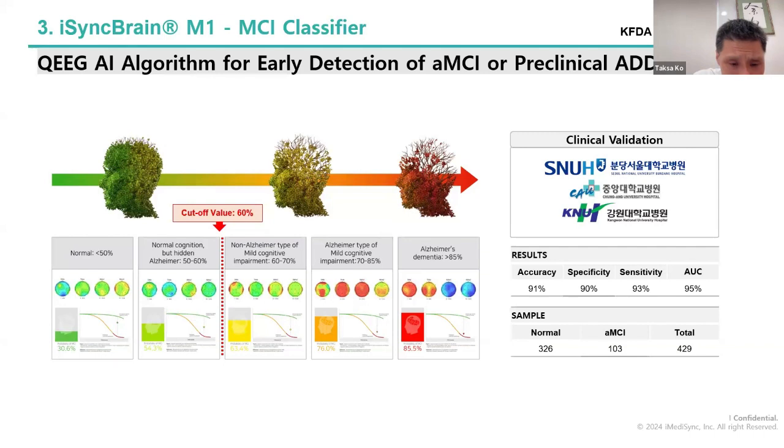And the point is, what kind of data is the AI working on?